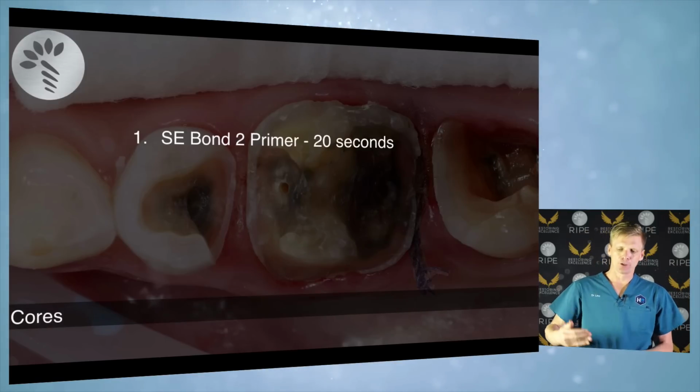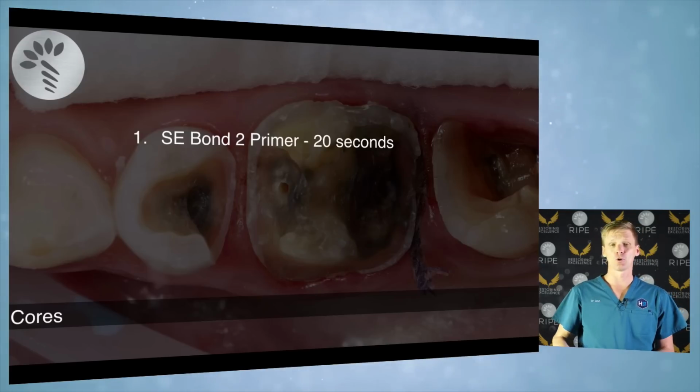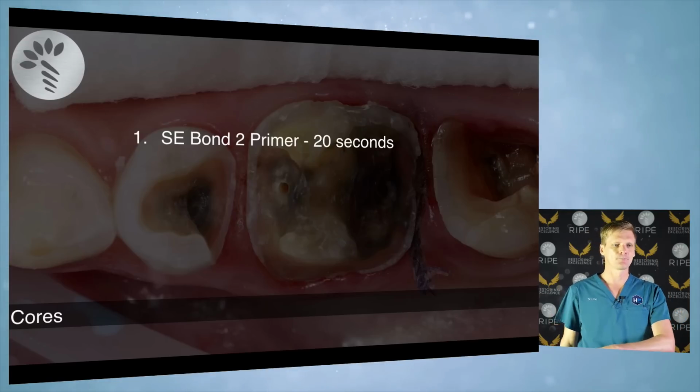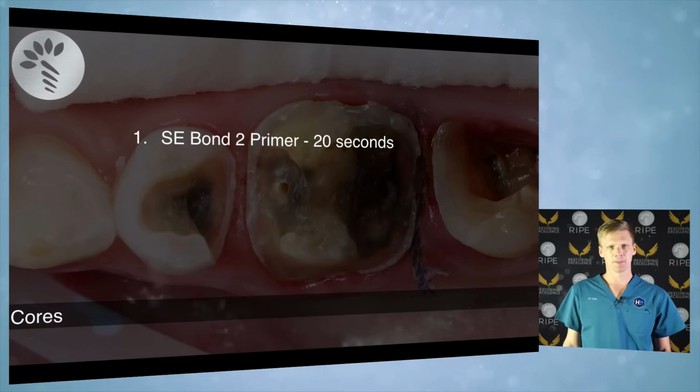Now, how do I do cores? I get asked this. I'm sure some of you have seen my webinars or lectures, and heard me talk about how I do cores. I get asked it every single week on Facebook. So I'm going to go through it for the half of you who haven't seen this or who've forgotten. I always use SE Bond 2 from Kerr. I have used this for 6 years, and the follow-ups are great.